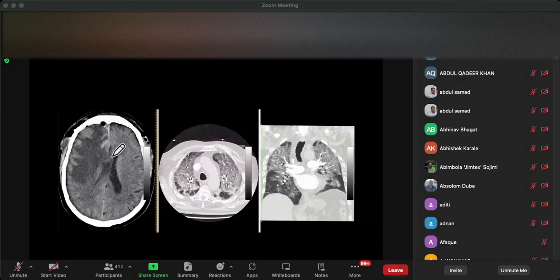Okay, this patient has had a craniotomy for a brain tumor. You can see the pneumocephalus here, recent surgery, and there's a bit of midline shift still. And then 2 weeks later, what's happened? Could be neurogenic pulmonary edema, or could it be anything else?